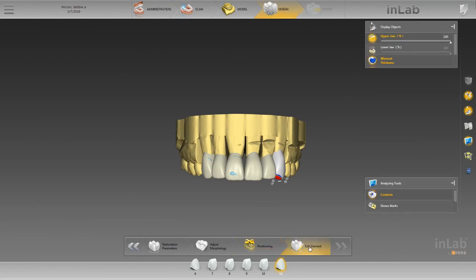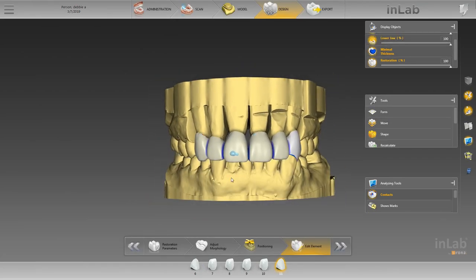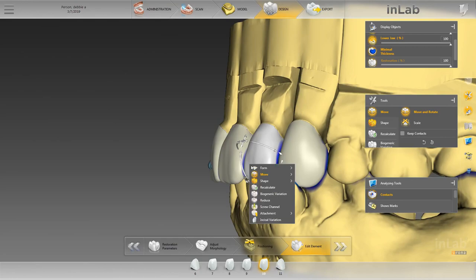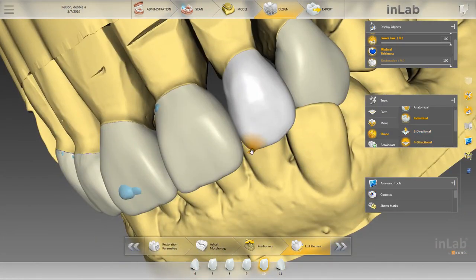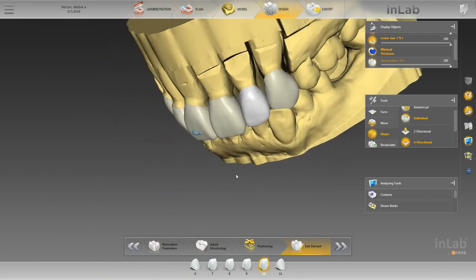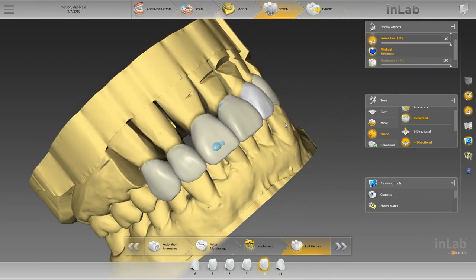All right, let's see the magic. First thing I like to do is biogeneric variation on whichever teeth we're going to be doing that on. Four directional, we're going to bring over the mesial incisal edge. That's good. So we've got the contour lines pretty much squared away with the shape tool how we want them. We'll leave this rounded. Why not?